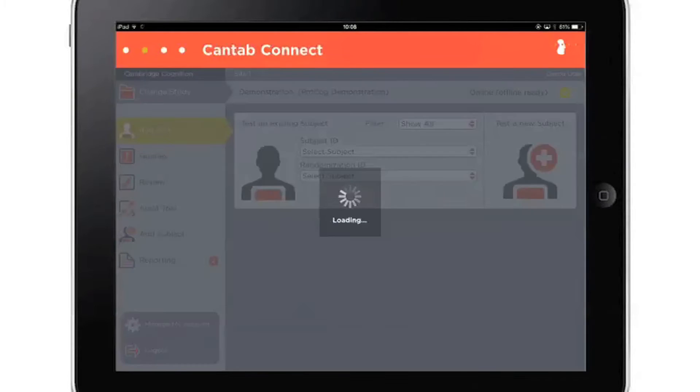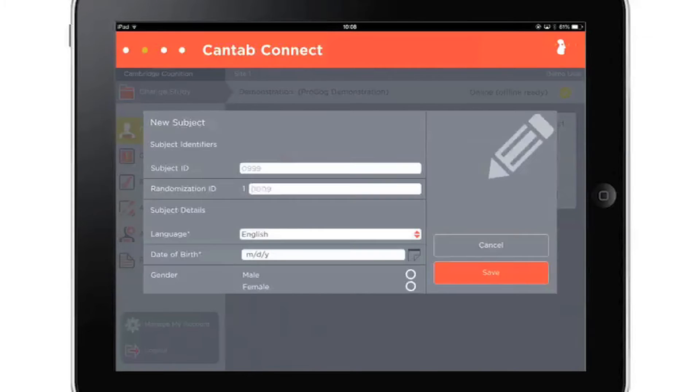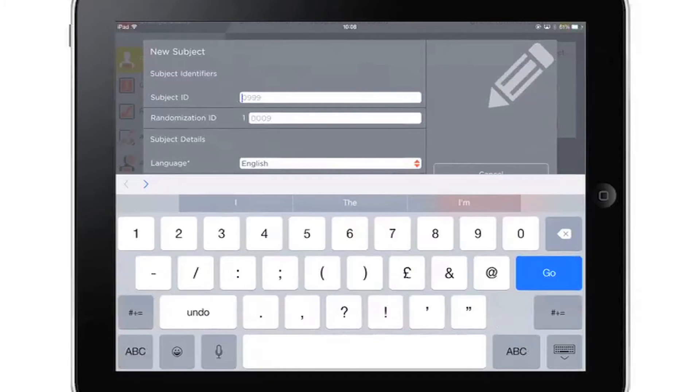To add a new subject, fill out the required demographic details in the form. Once added, the subject can be tested immediately.